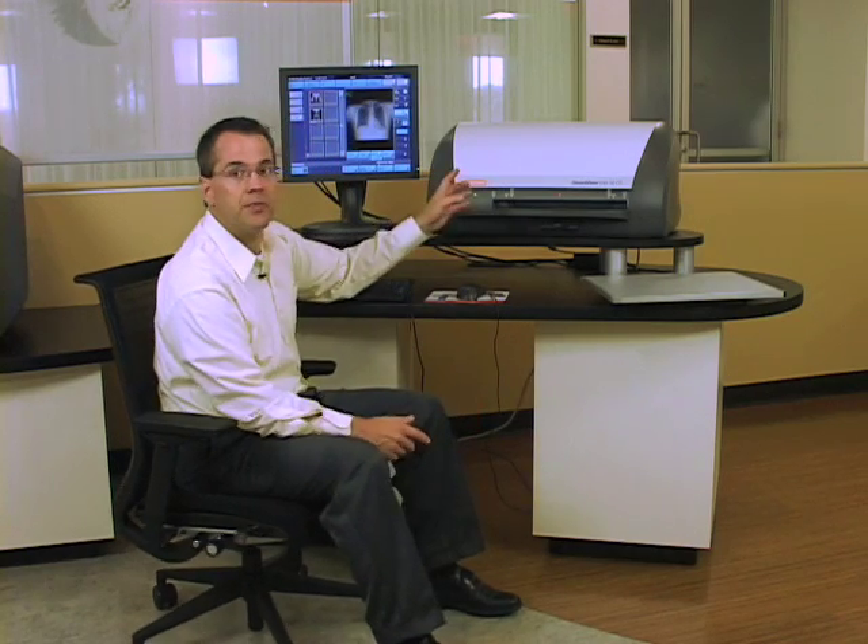The Vita CR is our latest CR. We have several in the product line across our desktop CRs. This one is a little bit lighter than our previous models, it's compact, and it's very robust. It does about 44 plates per hour — that's a 14 by 17 size cassette.